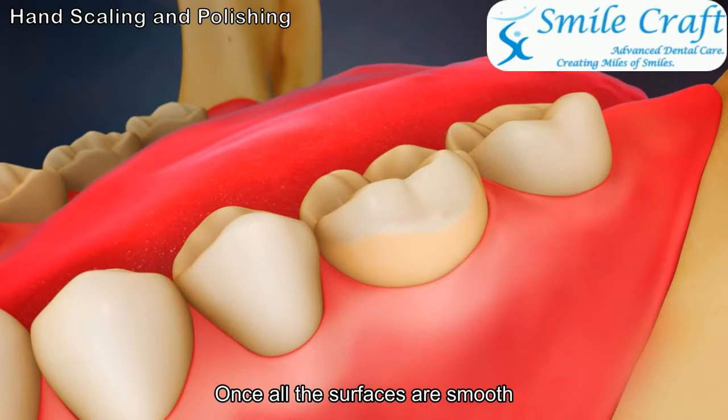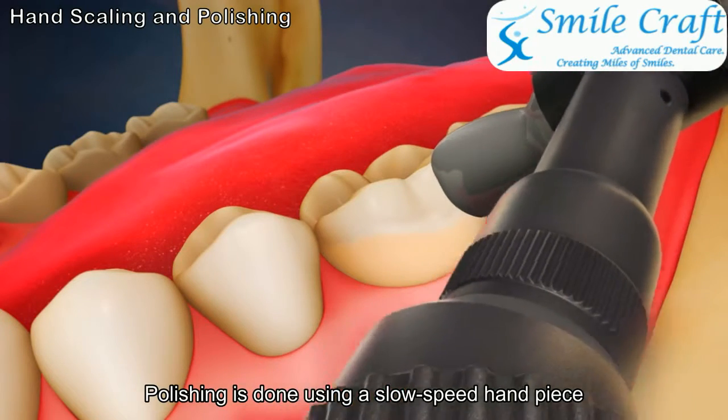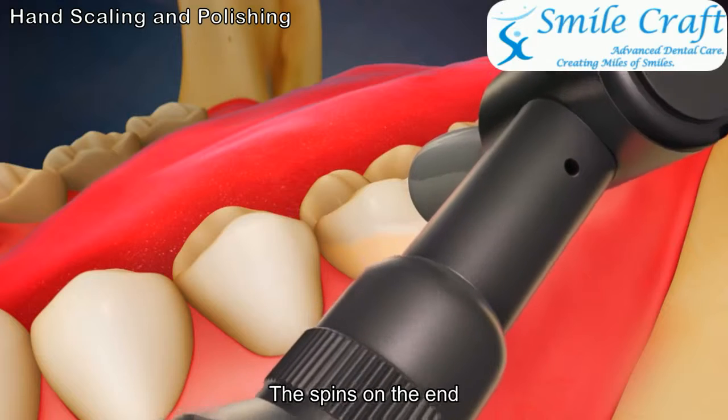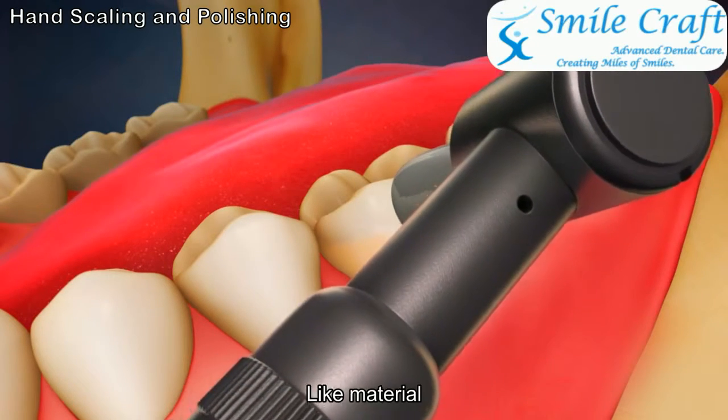Once all the surfaces are smooth, you may have your teeth polished. Polishing is done using a slow-speed handpiece with a soft rubber cup that spins on the end, along with a special gritty toothpaste-like material.